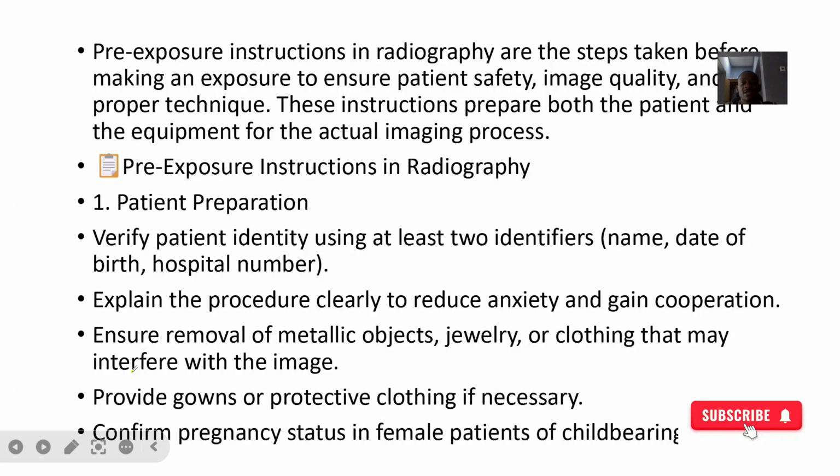Okay, so pre-exposure instructions in radiography are just the steps that are taken before a patient is exposed to radiation. And you are trying to ensure that you are giving the right instructions to the patient so that they are safe, so that they are able to position themselves rightly so they can have the best imaging.